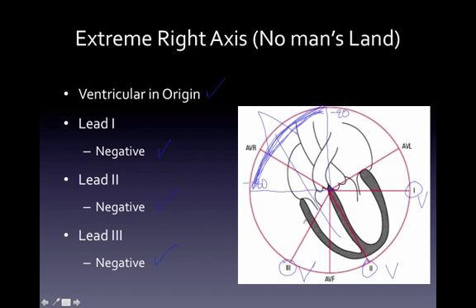Sometimes, whenever the machine sees multiple locations that the electricity is coming from, or multiple focal information, it will go back to a 360 degree point of view. So then your lead 1 is still the starting point at 0 degrees, but it's also 360. That means that this negative 90 changed to 270, and this is still 180.